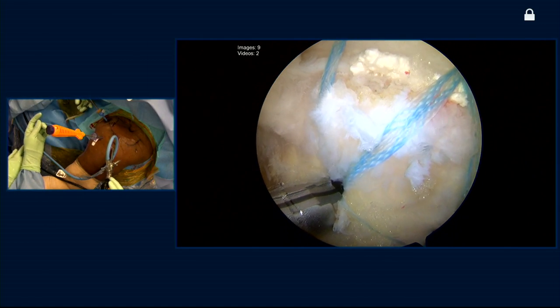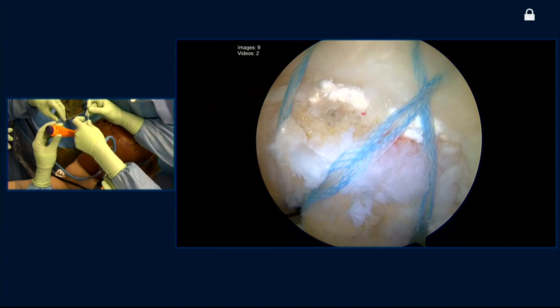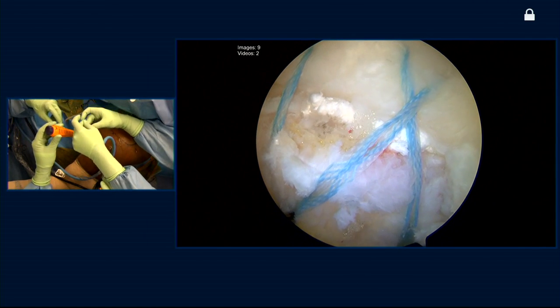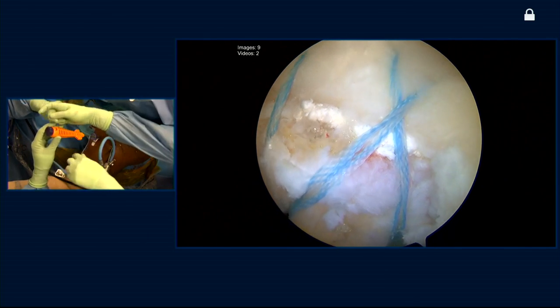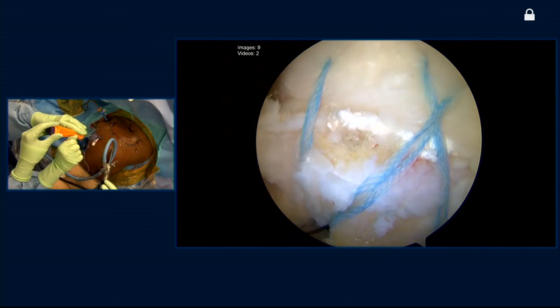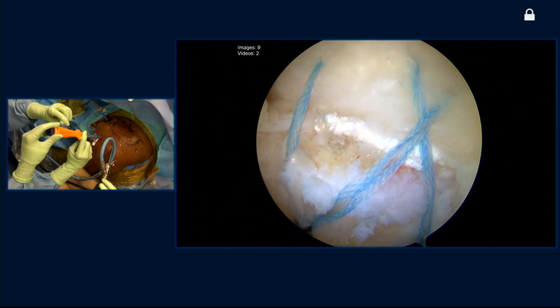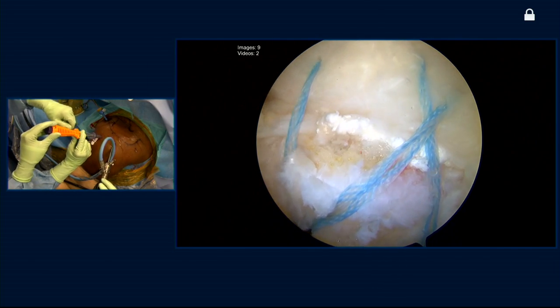And the final point is, as you see, we're doing this all in a knotless configuration. So it makes it easier for the surgeon, number one. And number two, I think there is a benefit for the patient in terms of no knots in the subacromial space that may cause irritation, clicking, noisiness, or pain. There's a psychological component too — when the patients hear or feel those knots, they think there's something wrong, even though it may be a perfect repair.